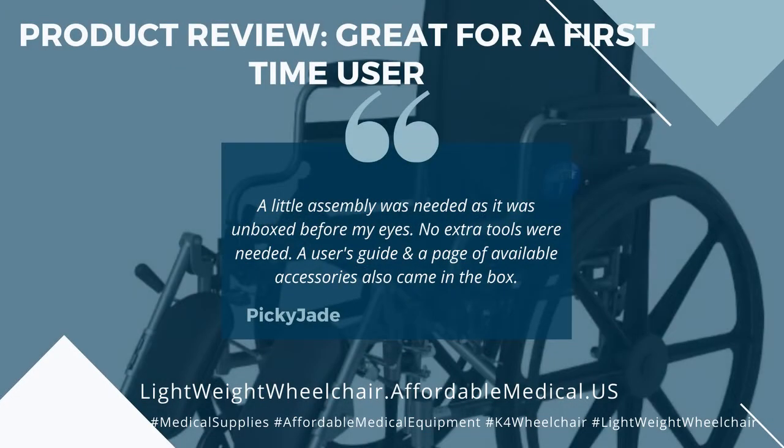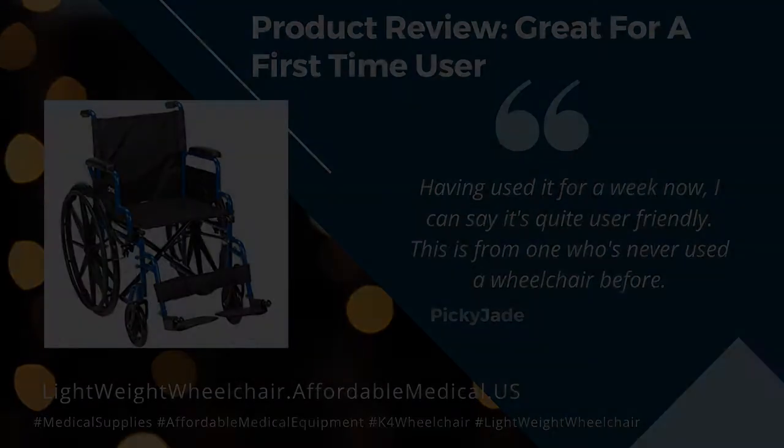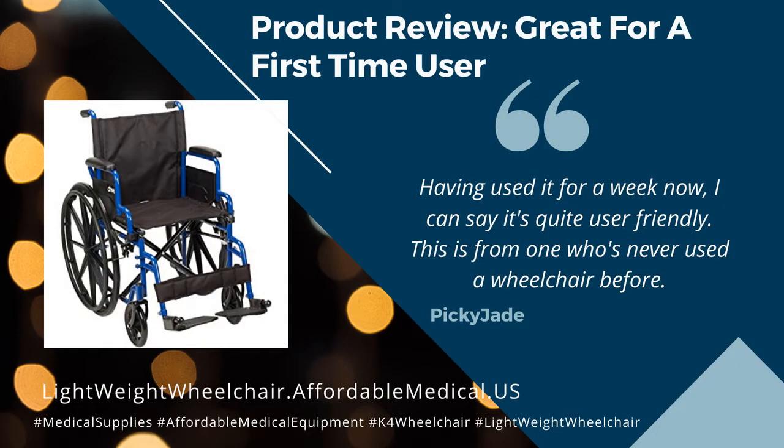A little assembly was needed as it was unboxed before my eyes — no extra tools were needed. A user's guide and a page of available accessories also came in the box. Having used it for a week now, I can say it's quite user-friendly.